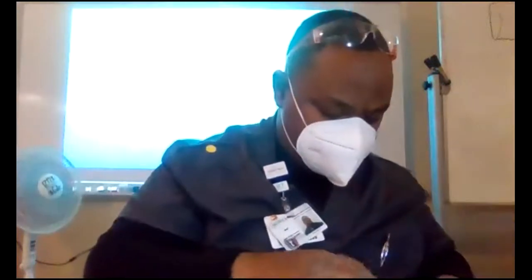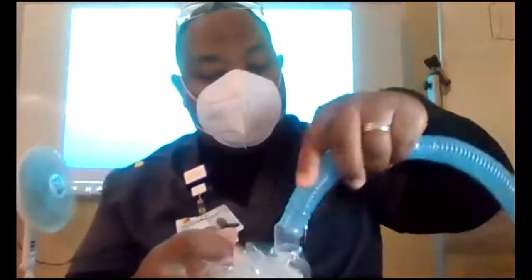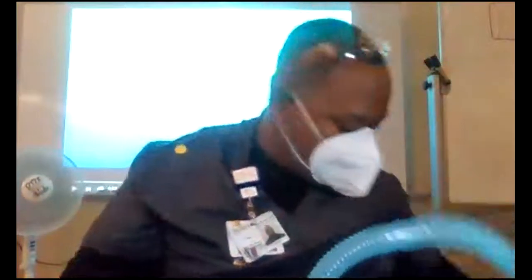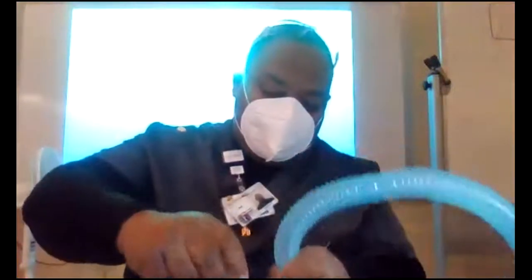So let me get my scissors right quick. All right, so this is my large bore tube. I'm just gonna cut this for demonstration. There's no certain amount on there. All right, so one will come from the machine or the ventilator, whatever is producing your gas. One end will go on here like that, coming from the machine. And the other end will go on this side, coming to who? The patient. Just go to your aerosol trach collar or whatever it is you have, right? If you have a direct trach or ET tube or just a mask or whatever is being used, all right?